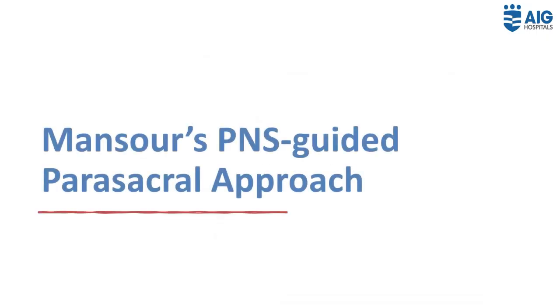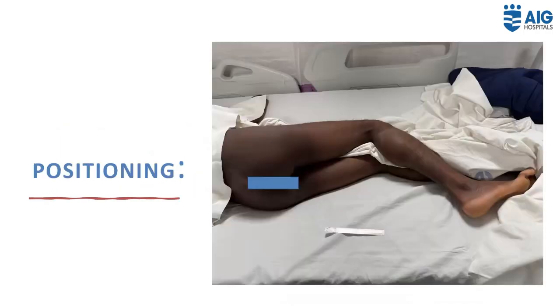Coming to Mansour's PNS guided parasacral approach, this approach to the sciatic nerve is a true sacral plexus block because here the injection of local anesthetic is in the fascial plane around the branches of the entire sacral plexus before the sciatic nerve is formed. The positioning will be the same as for lumbar plexus block, except that in this case, we'll have to keep the foot uncovered because the end point is plantar or dorsiflexion or eversion of the foot.